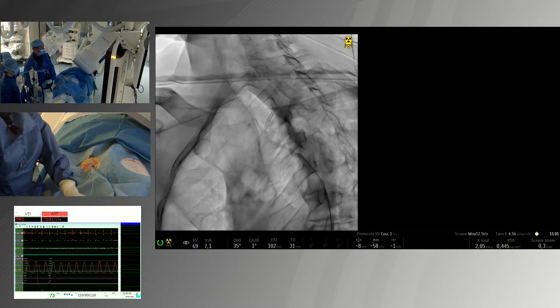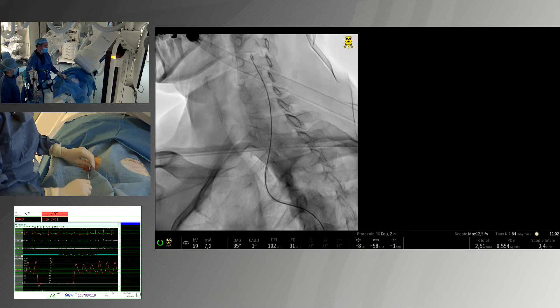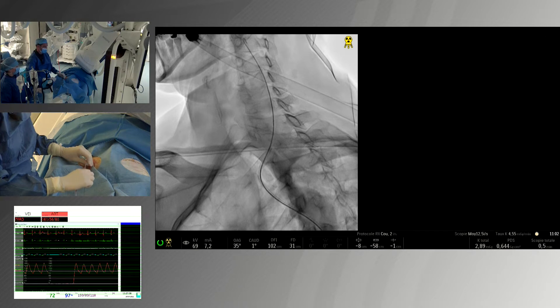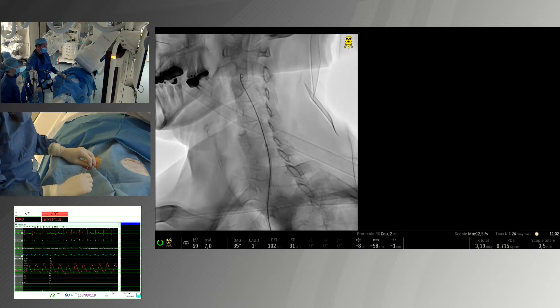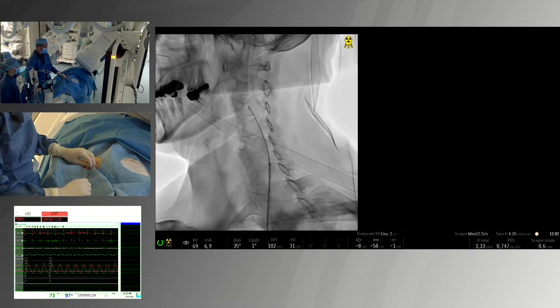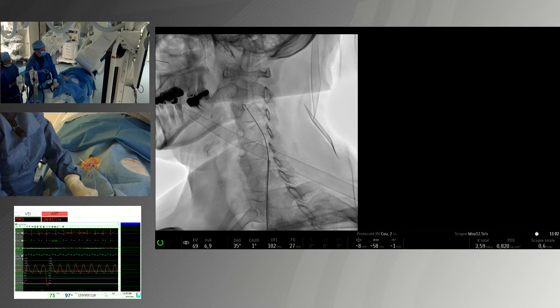The patient has a very severe left carotid stenosis. We are now in the left carotid — we know this because we were previously in the subclavian. Progressively, the guiding catheter is pushed softly toward the inside of the common carotid. We are now in place.